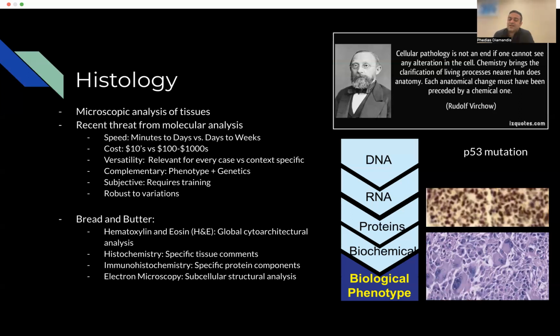When we see this, it usually indicates that you have a P53 mutation or a mismatch repair mutation. And so a mutation in DNA repair, genome guardian genes, which we cannot see directly, will lead to an upregulation of this defective protein, which we can make out by immunohistochemistry. But we can also see it by morphology.